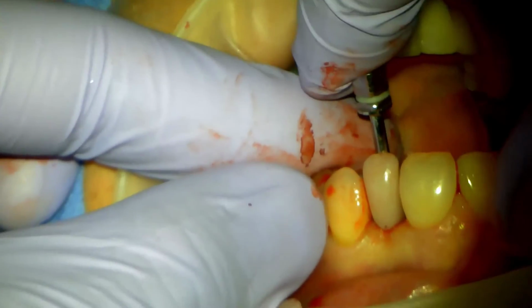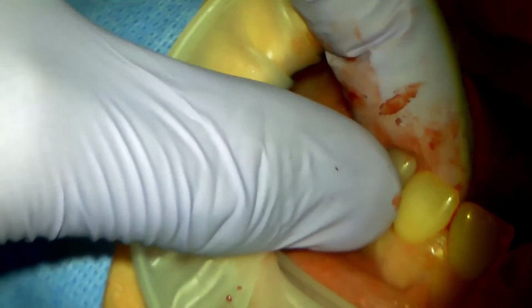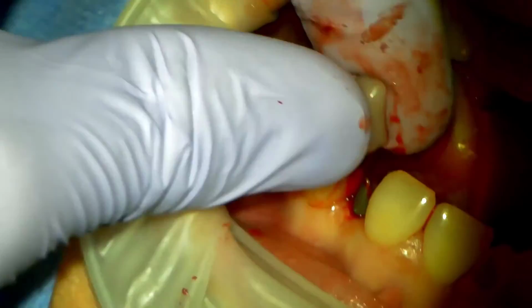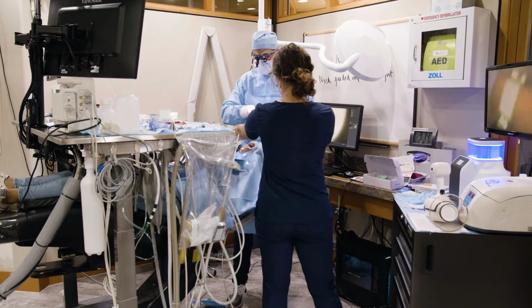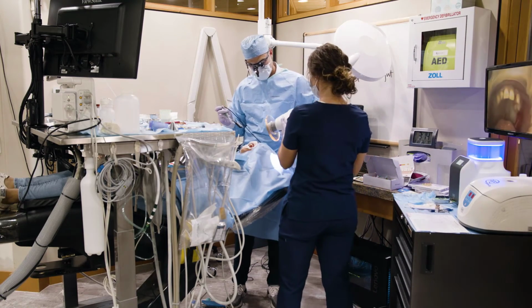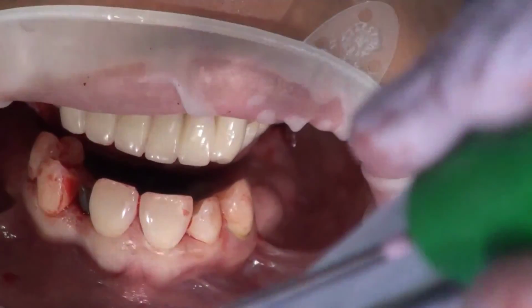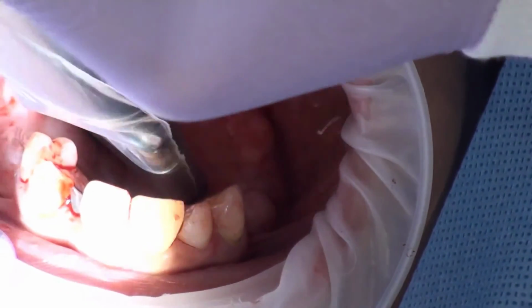Appears to be down all the way. Let me go ahead and take this off. This looks like it's in a good position. We're going to go ahead and take an x-ray and look at the seat. Okay, real big for me. How big can you open? There you go.